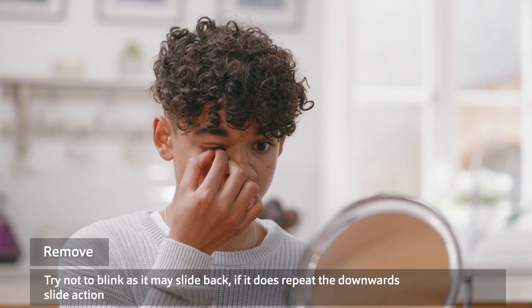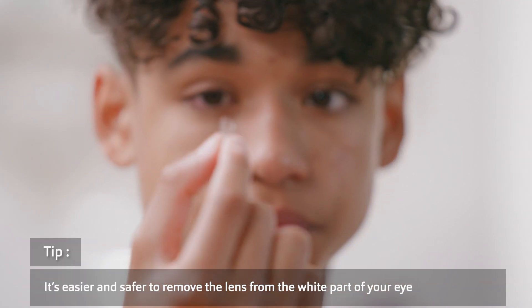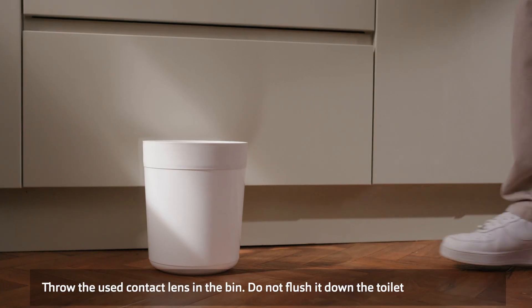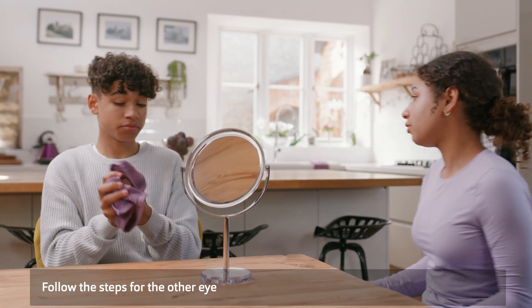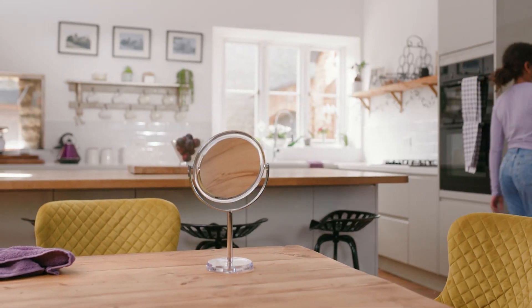Using your thumb and first finger, gently pinch the lens and remove it from your eye. It's easier and safer to remove the lens from the white part of your eye. Throw the used contact lens in the bin — do not flush it down the toilet. Now follow the steps again for the other eye. All finished — brilliant!